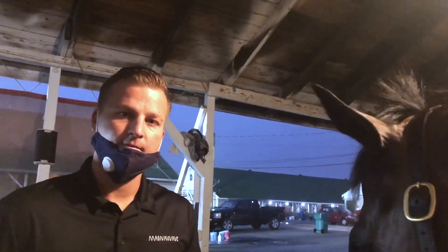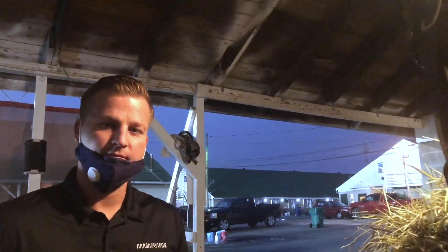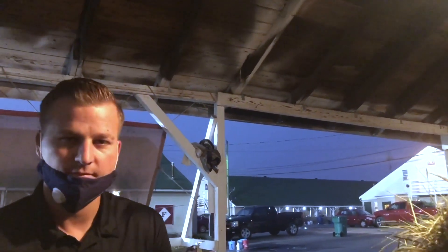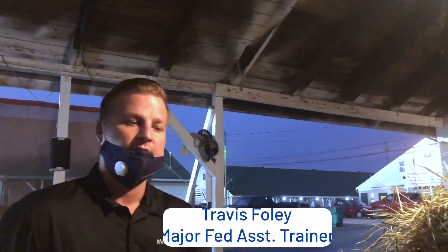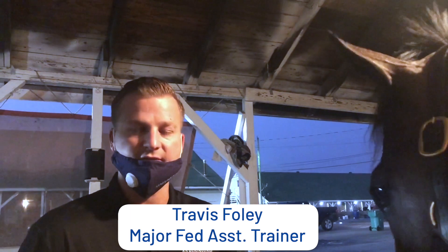This horse is very sound, but every barn has their horses with some little aches and pains — they are athletes after all. So what are some of the common injuries and situations that you use MagnaWave on? It's good for everything. Predominantly we use it for, as you see with Fed, the soft tissue.